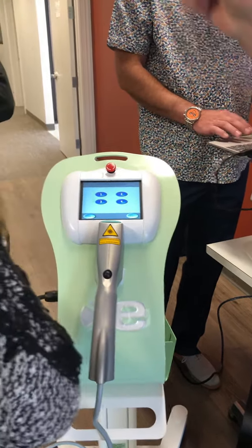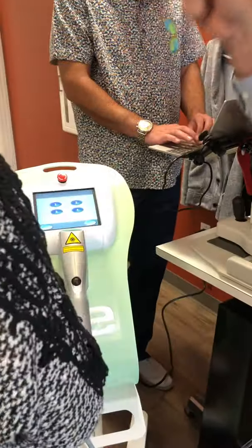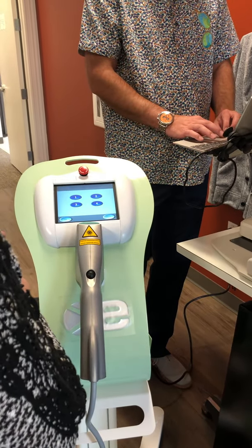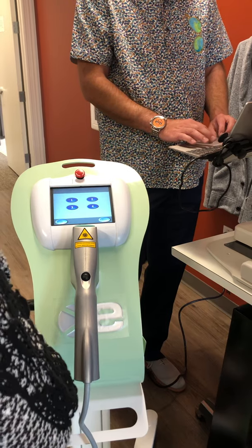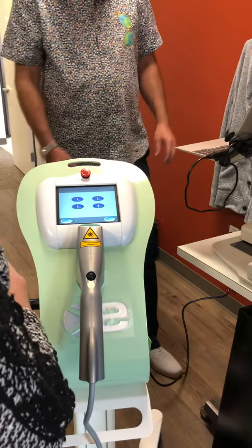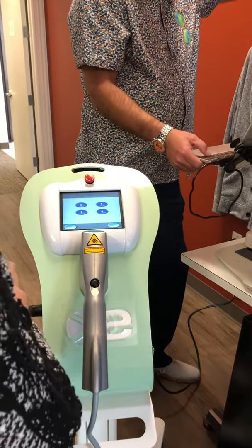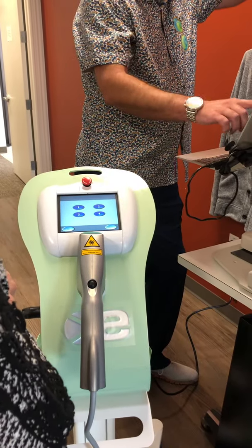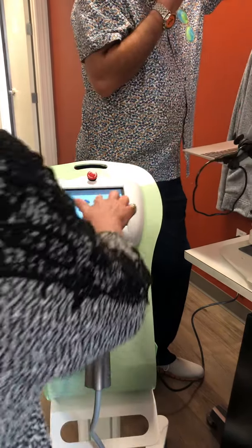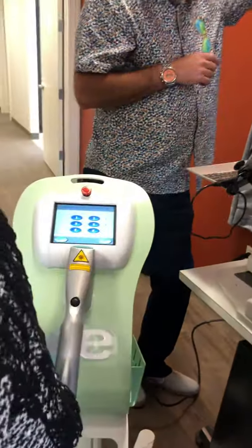Okay? For you two doctors, when we do an IPL, the sequence of time between IPL has to be a minimum of a week. So if I treated her today and she goes, oh boy, that's better, but we know we needed to treat her a second or third time to get the intended outcome, a week later. Okay? So let's hit 2, because we're making that assumption.